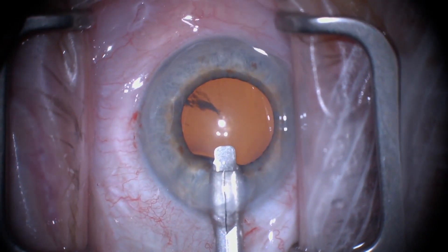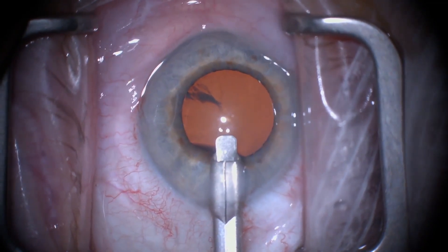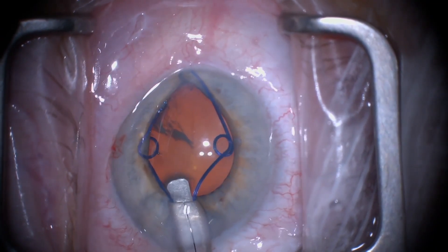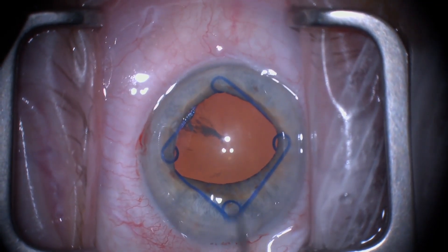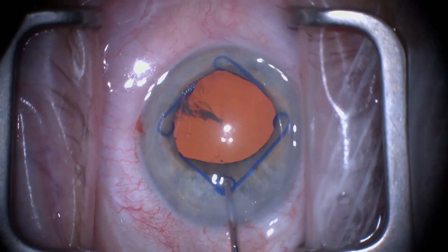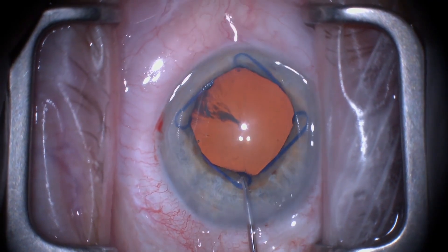When placing the ring, always capture the distal iris with the scroll of the ring, as you can see here. Then, as the ring is further inserted, gently tilt the device allowing iris capture with the medial and lateral scrolls of the ring. As three facets of the ring are already nicely in place, the proximal aspect of the ring can easily be manipulated into place.